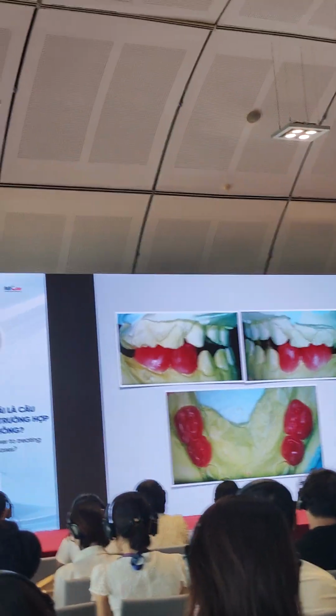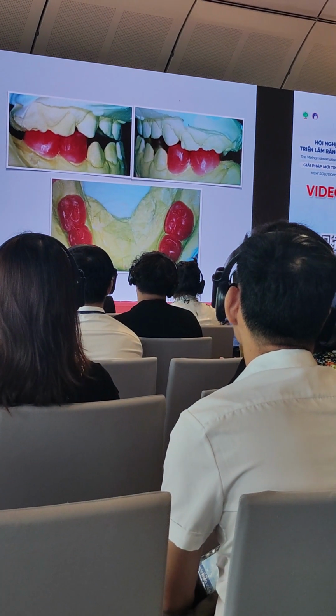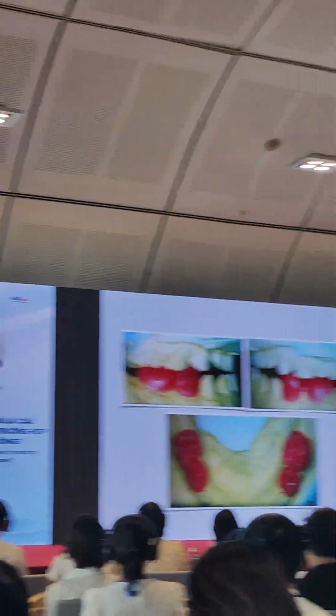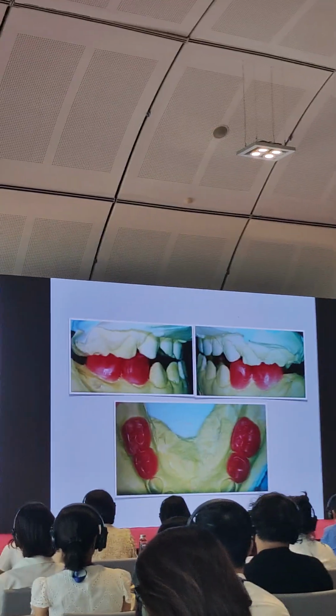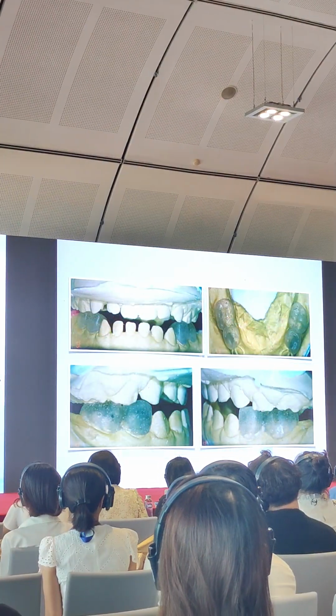And from that working bite, we were able to place it in the articulator. Of course, the mandible will be based on where we want them. So after carving it, take an impression and pour self-cure acrylic. Then you now have an acrylic.